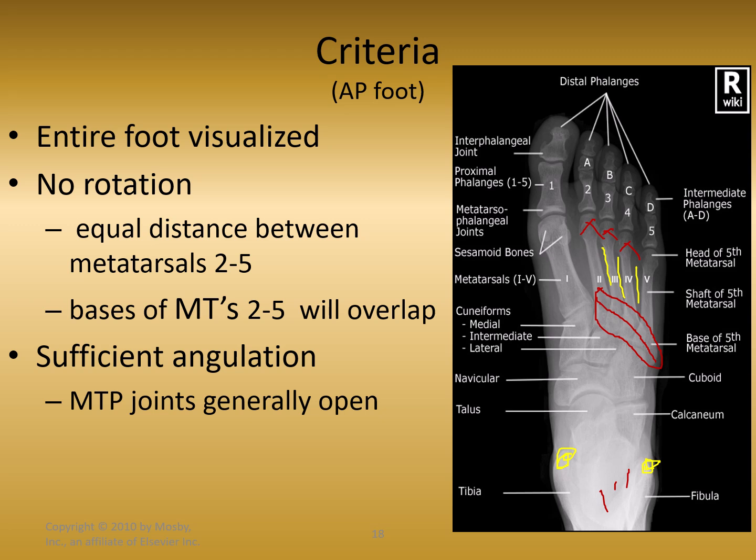Okay, and then sufficient angulation is demonstrated by those joint spaces being clearly demonstrated open. That lets us know that the tech did indeed angle the tube, and that the central ray went through those joint spaces without projecting bone into the joint space and superimposing them.